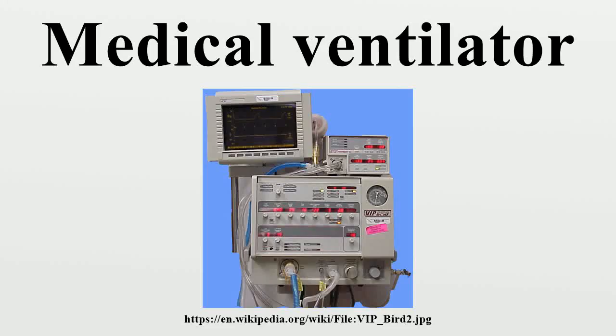A medical ventilator is a machine designed to mechanically move breathable air into and out of the lungs, to provide the mechanism of breathing for a patient who is physically unable to breathe, or breathing insufficiently. While modern ventilators are computerized machines, patients can be ventilated with a bag valve mask, a simple, hand-operated bag valve mask. Ventilators are chiefly used in intensive care medicine, home care, and emergency medicine and in anesthesia.